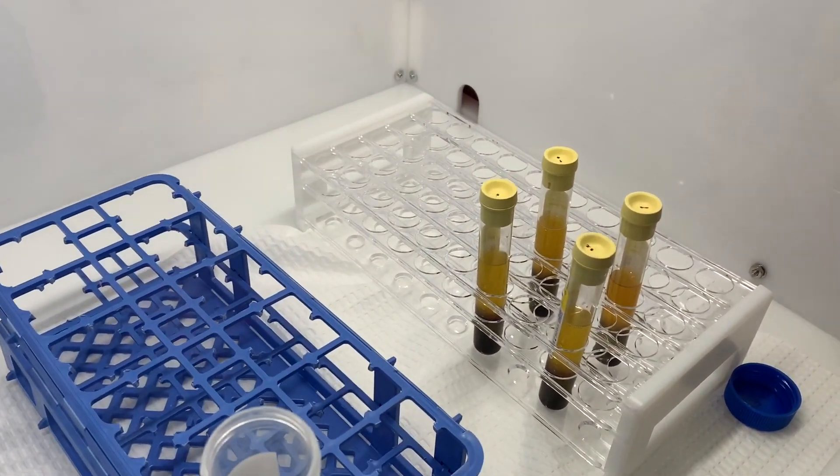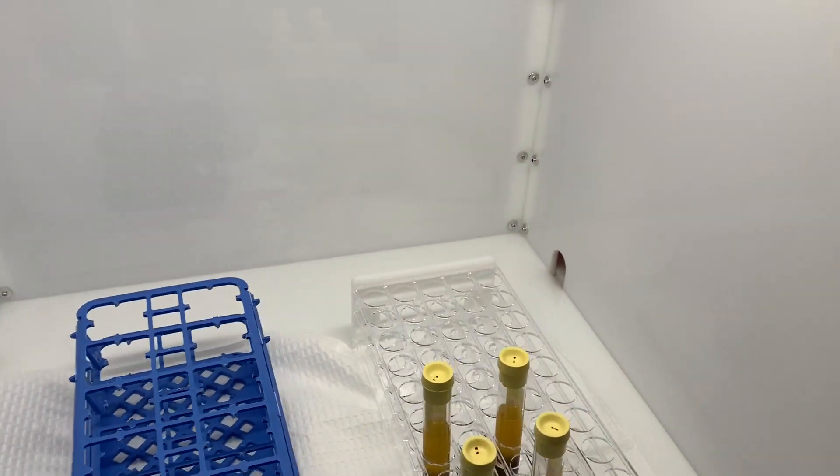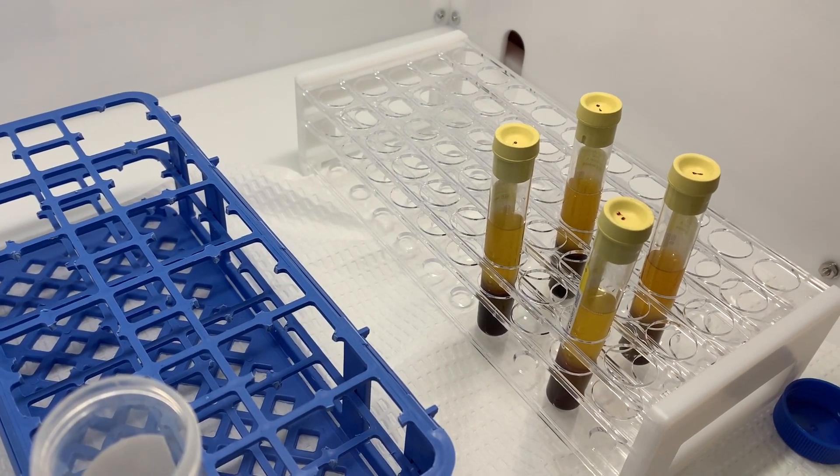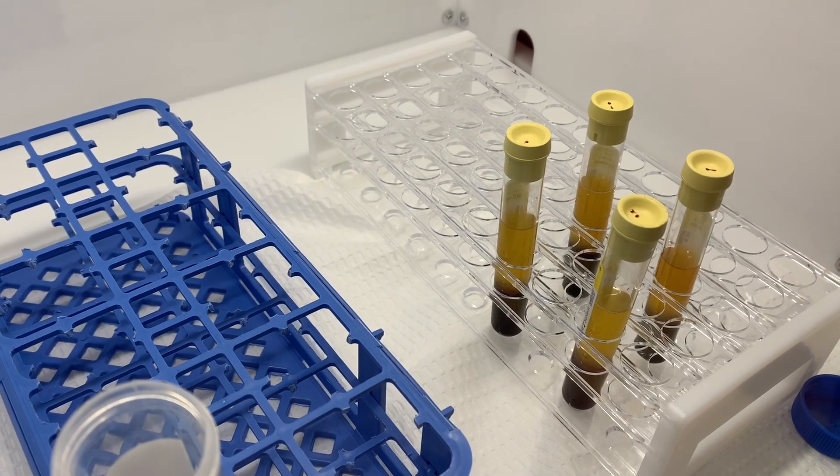The blood has been spun and it's now separated. You see the gold stuff at the top — those are all the platelets, the healing chemicals. And then at the bottom are all the cells that we're going to discard.